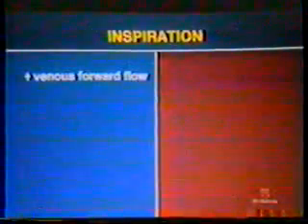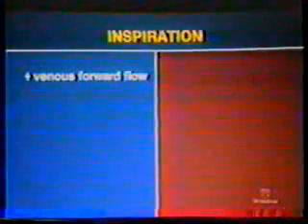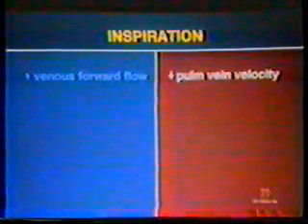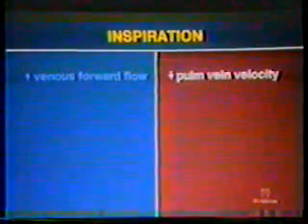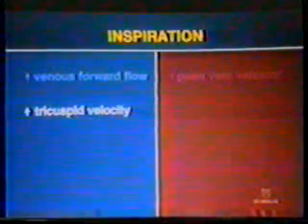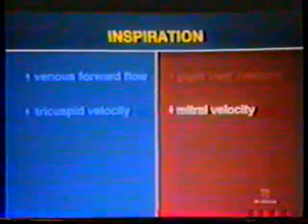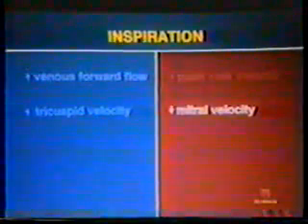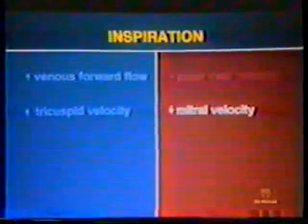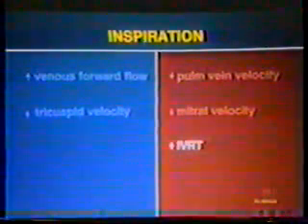To summarize the pulsed wave Doppler changes that occur in patients with cardiac tamponade, with inspiration, there is an increase in the forward flow velocity in the hepatic vein and a decrease in the pulmonary vein velocity. Inspiration also results in increase in the tricuspid velocity, especially an increase in the e-velocity, while the mitral velocity decreases with inspiration. The reduced diastolic filling gradient on the left side means that mitral opening will be delayed, and hence the IVRT increases with inspiration.